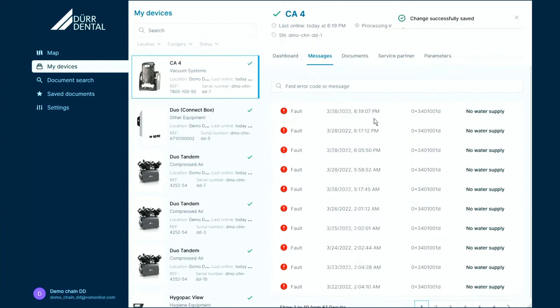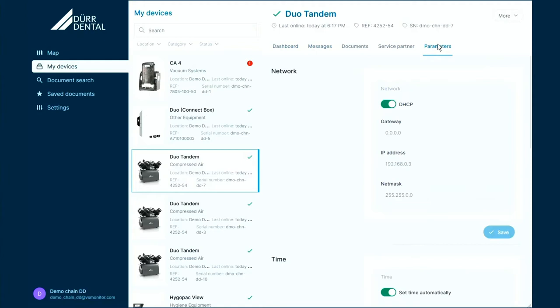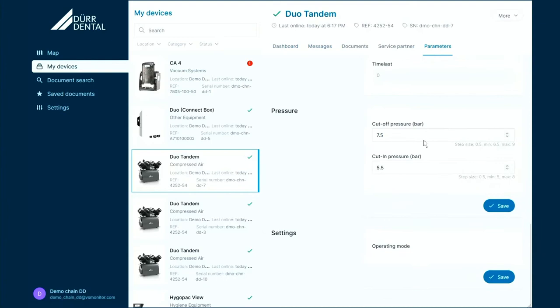VistaSoft Monitor offers more than that. We don't just get information from the devices, but also give you the possibility to see the parameters which are active in your devices, adapt them, and optimize them as you go — for example, the pressure range of a compressor.